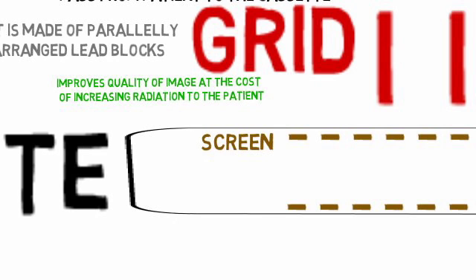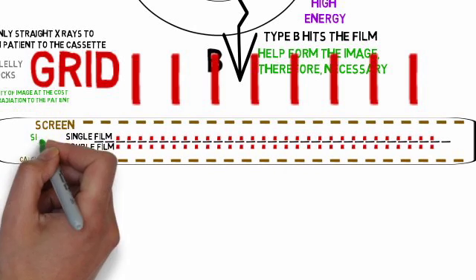This is the screen. Screen is made up of calcium tungstate. And this is the single film, and this is the double film. Both of these are made up of silver bromide.